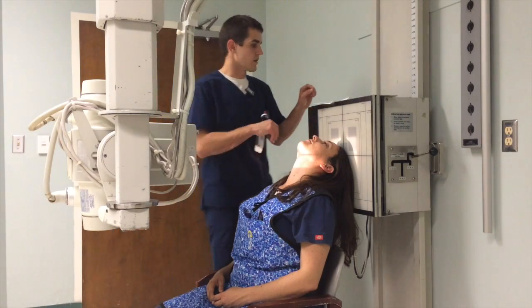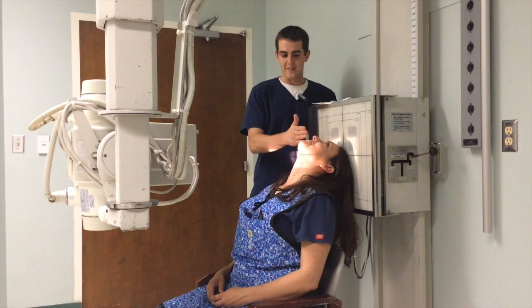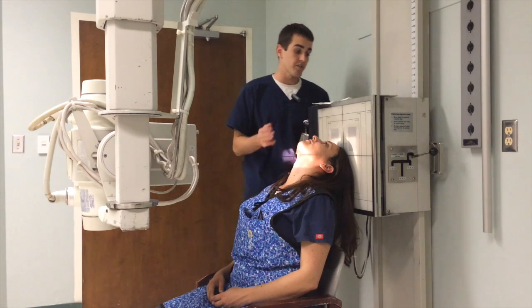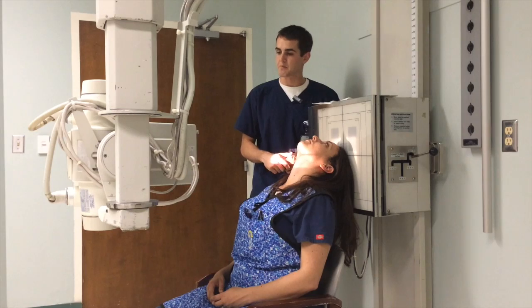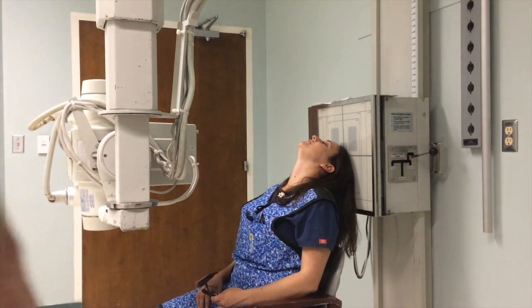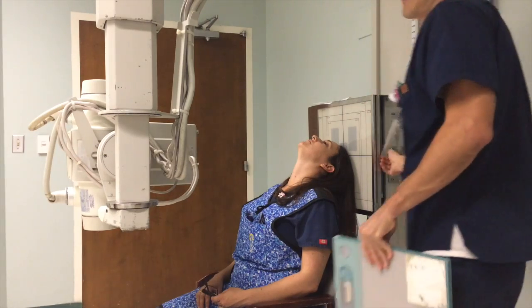It's not a fun view for the patient to hold, so we're going to go ahead and hurry up. But again, we have the OML parallel with the IR, mid-sagittal plane perpendicular, centered perpendicular. We have our marker on, patient's shielded, and we're getting the zygomatic arches free of superimposition. So I'm going to set this. Hold still. Beep. All right, so our final image, we're going to switch out our IRs one last time.